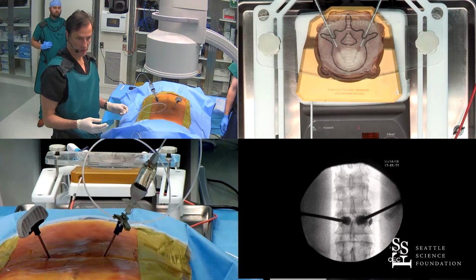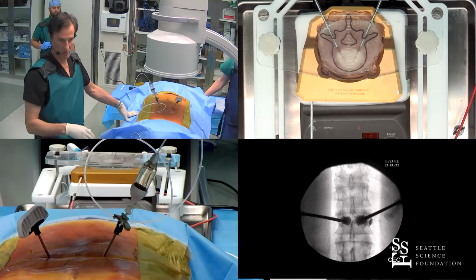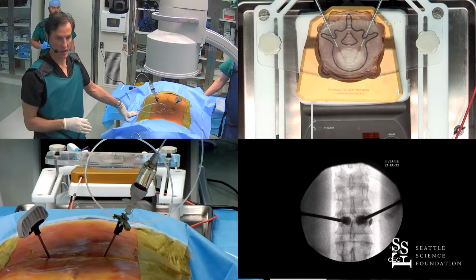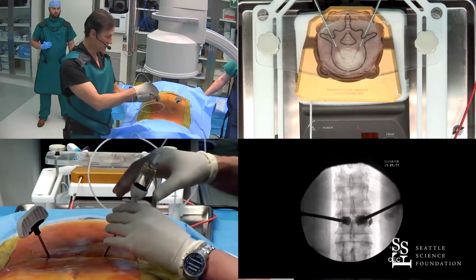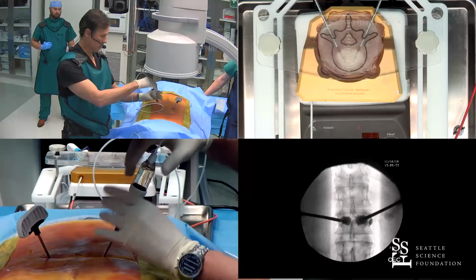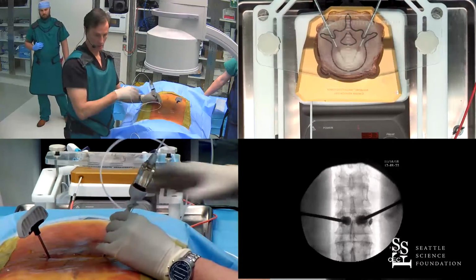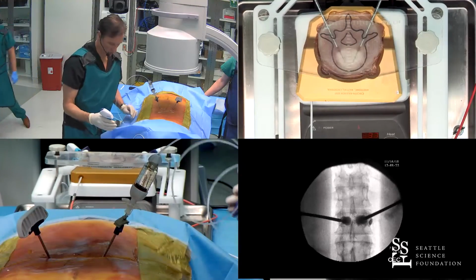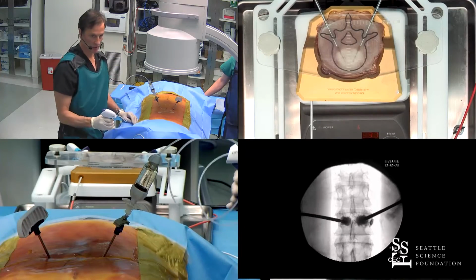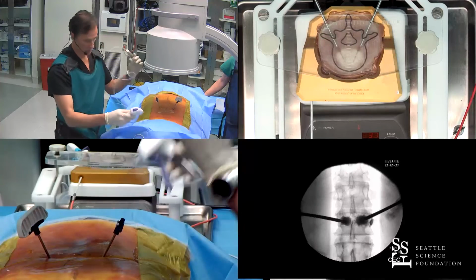So cement extravasation happens in the EVOLVE trial 21.7% of the time. This is the most common type of extravasation, out the side. Number of serious adverse events or SAEs, 0 from the entire trial of 354 patients. And so, in instances where there's extravasation, when should you worry? Extravasation, whenever it comes posteriorly, is the only time you really have to worry about it. And I'm going to put just a little bit more. Yeah, we have some more cement.